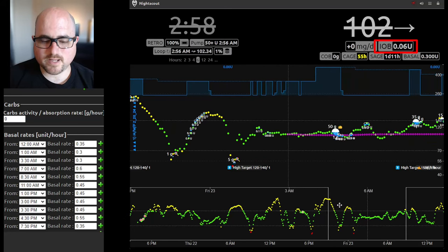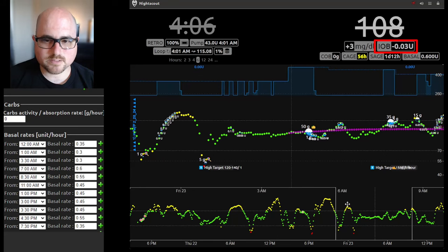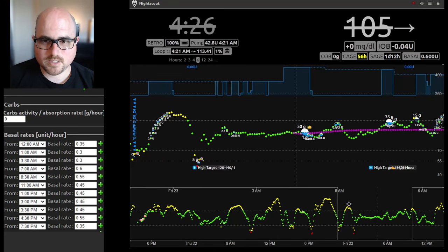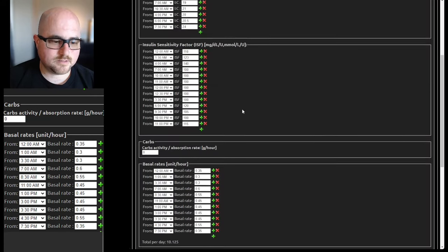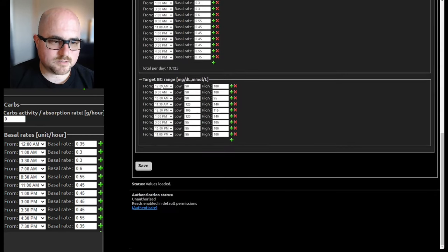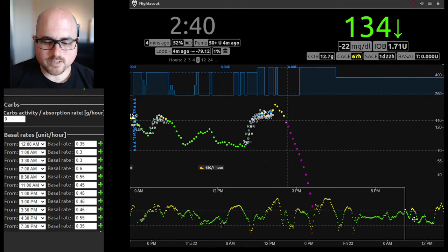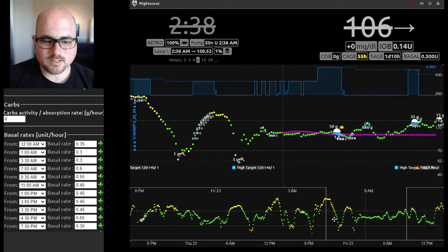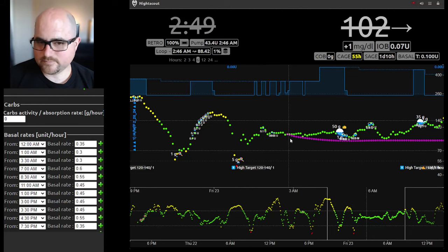Now we get a nice flat line and we're at kind of zero insulin on board, right around zero the whole time. Now we're going to check real fast on their settings. They still have a lot of ranges — that's kind of in the ballpark. 11:30 is starting to get in range, trying to shoot for 120–140. Level and in range — that's good. That tells us that likely the basal rates around this time are fairly accurate.